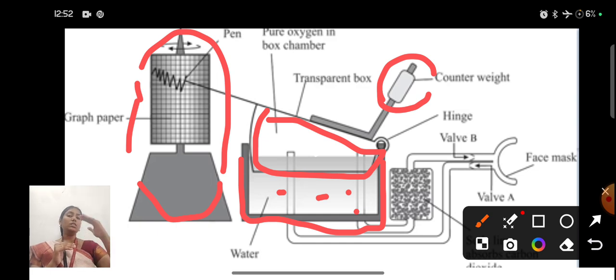So this pattern clearly reveals the mechanism of a person breathing. From this they come to know what the tidal volume is. Whereas if they are doing deep ventilation, that is deep exhalation and inhalation, they come to know the inspired volume and the expired volume. From these values we can easily calculate the capacity, vital capacity or total lung capacity. This is how we make a calculation with the help of this setup, that is, the spirometer setup.